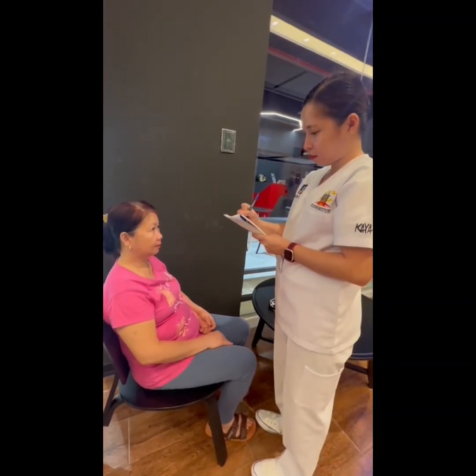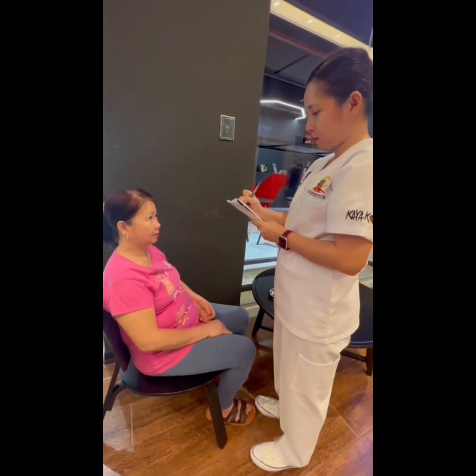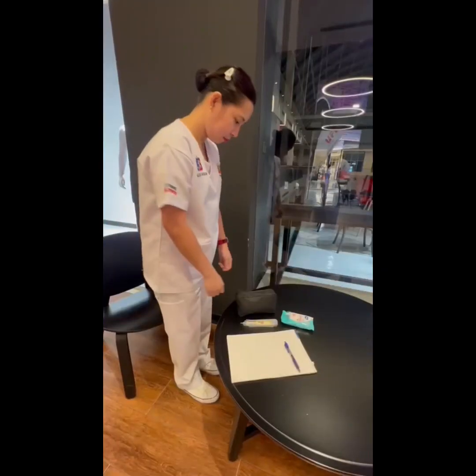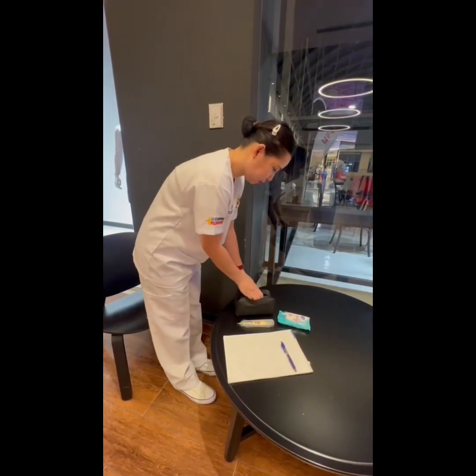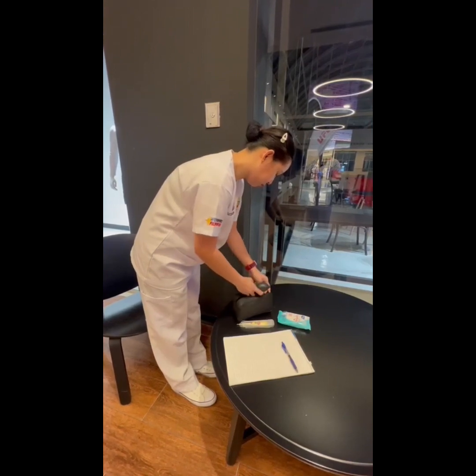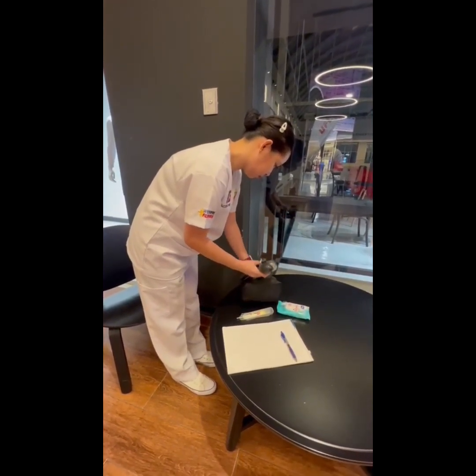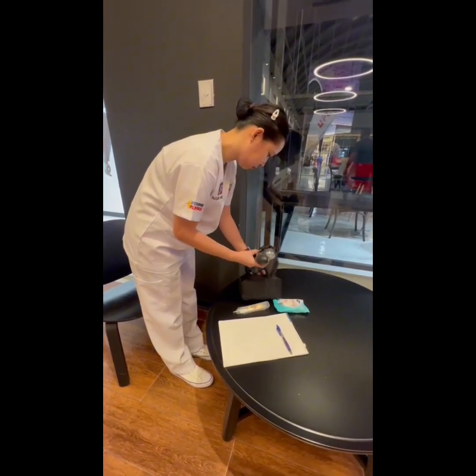Good day, student nursing assistants. For today's video, we will be demonstrating how to assess vital signs. The first step you have to do is identify the patient, discuss the procedure, and assess the patient's ability to assist in the procedure. This promotes active participation of the patient during the procedure.